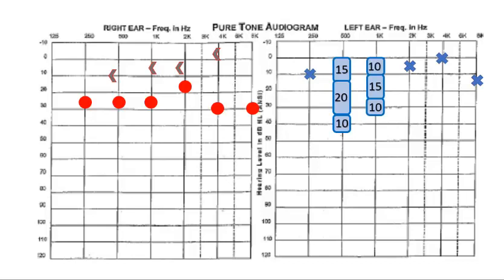Here are the IMLs for 500 and 1000 Hz using this method. With appropriate levels of masking, we can collect fully and appropriately masked bone conduction hearing thresholds. In this case, it's a sensorineural hearing loss, as the bone conduction threshold shifted with the introduction of the masking noise to the left non-test ear.